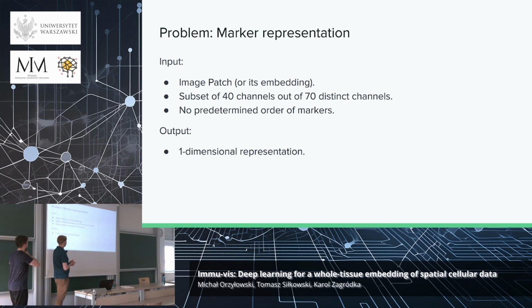This is a little bit of a weird problem, because we don't know what channels are going to be used, and there is no predetermined sequence in those channels. So we want to somehow encode what channels are present and apply them to a particular channel to associate it with a particular input. And as far as I understood, this concept isn't that weird, but there is nothing in the literature that applies directly to this.